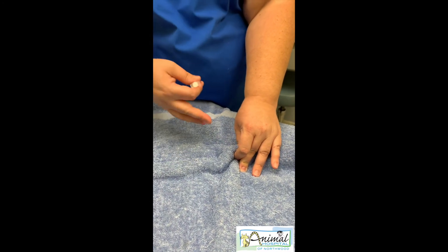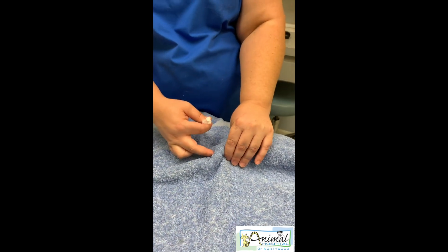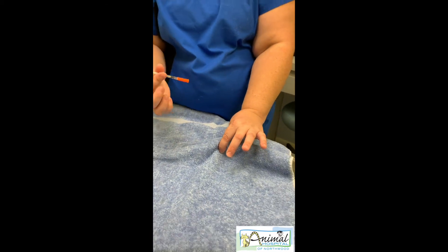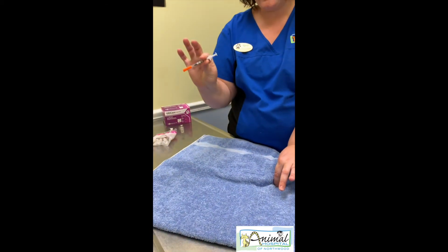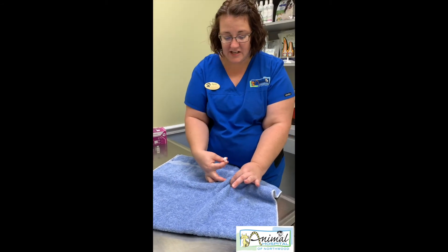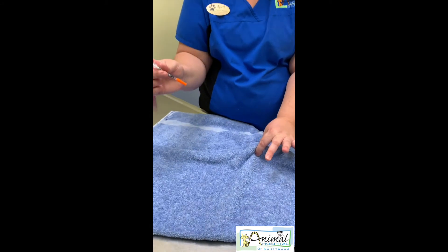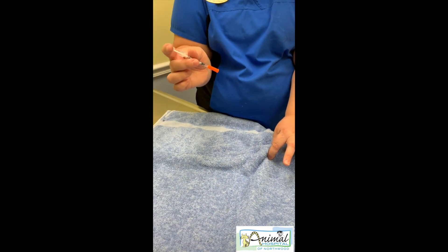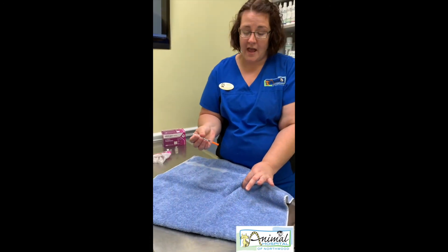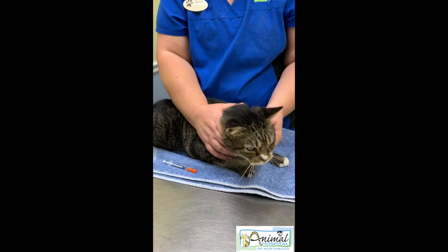When I bring the cat in, we'll look for the head, then pinch that skin and make our little tent. When holding the syringe, I hold it with my index finger and thumb so I'm able to feel for my indentation with another finger without accidentally depressing the plunger. You never want your finger on the plunger ready to go too early, because animals move and you'll squirt the insulin out before you've even gotten to your pet.